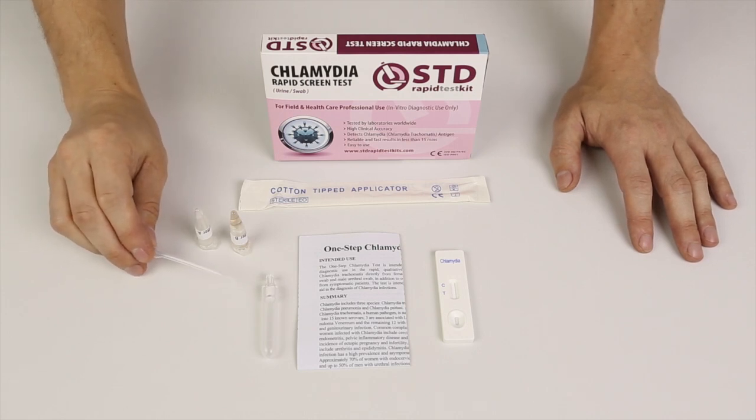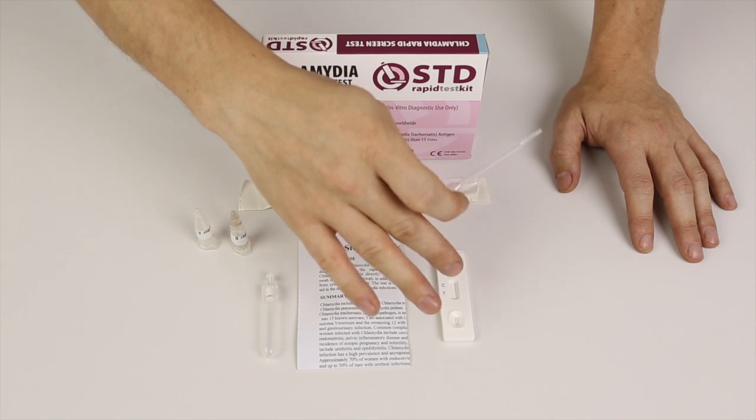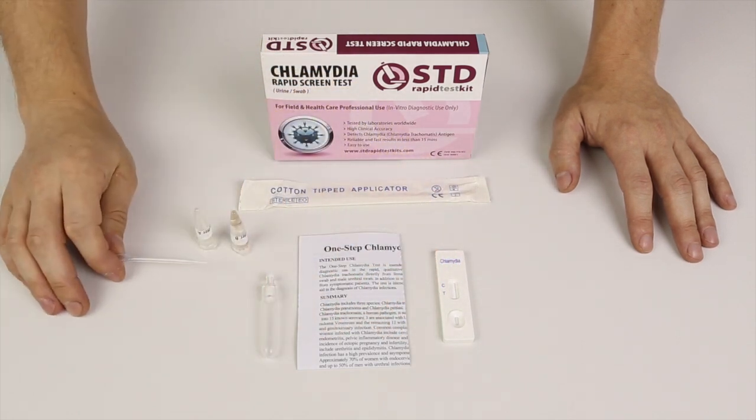We're going to show you how everything is carried out. So we've got all the parts: the dropper, the test cassette, buffer A and buffer B, the one swab and the mixing tube. That's all we need.